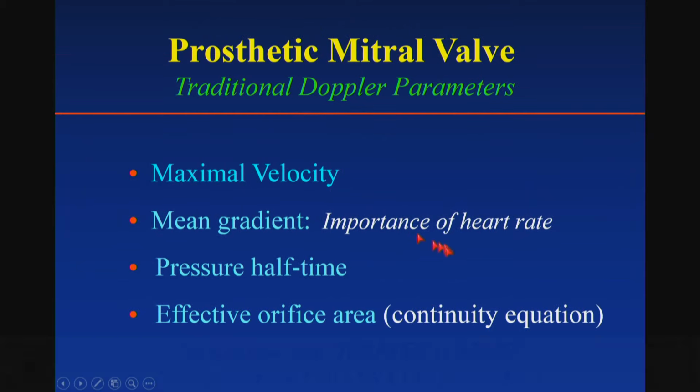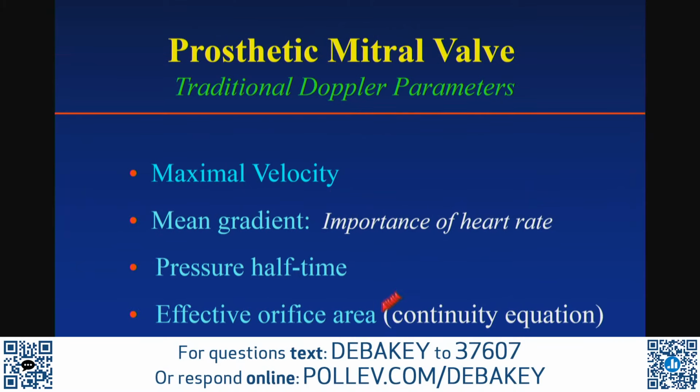The Doppler parameters that we use are maximal velocity, mean gradient. However, please, if you are the reporting physician, report a heart rate always with it, because it is very heart rate dependent as opposed to, let's say, an aortic prosthesis. Pressure half time is an index.